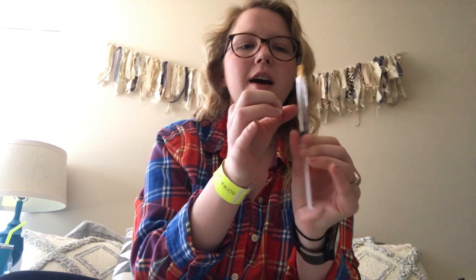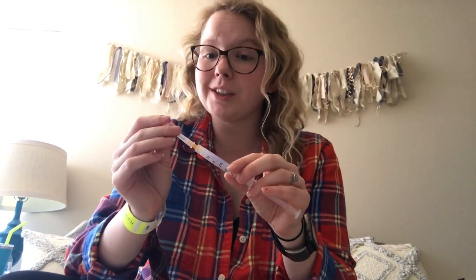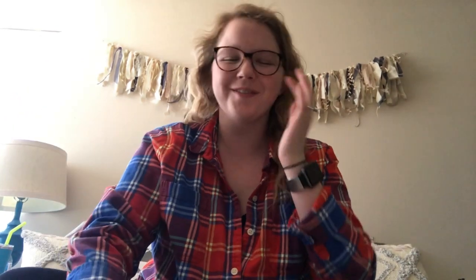There are little air bubbles in there, so I'm just going to flick them out and make them all go to the top, and then I'm going to push until I see insulin come out the top — perfect. I'm going to put a cap on this. You're not supposed to recap your needles but it's okay, I'm a seasoned pro at this point.